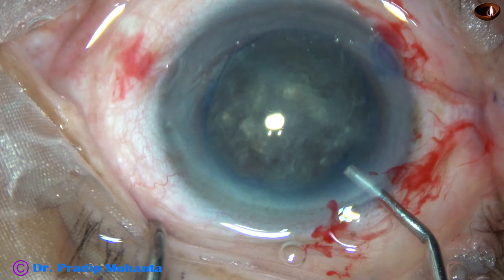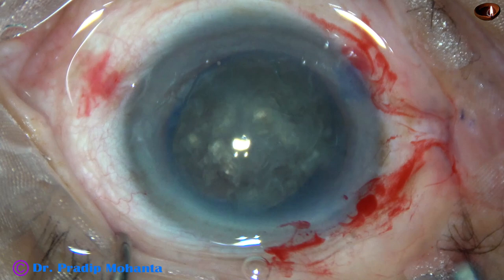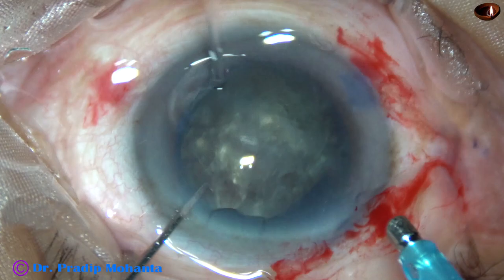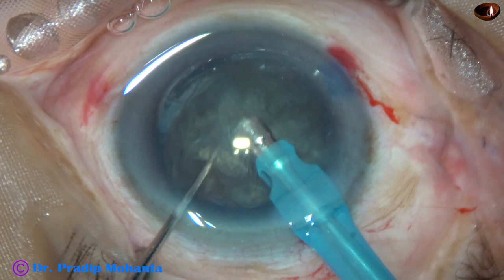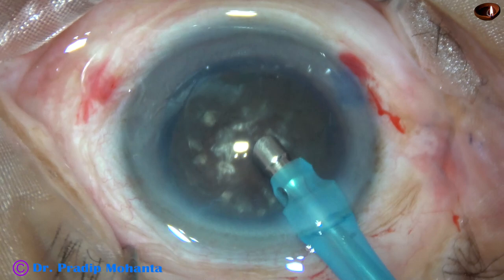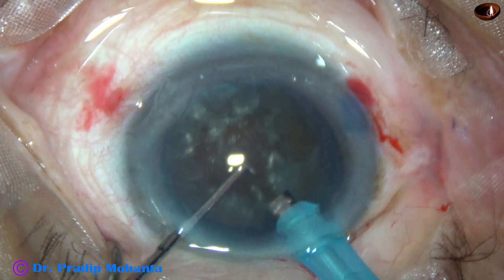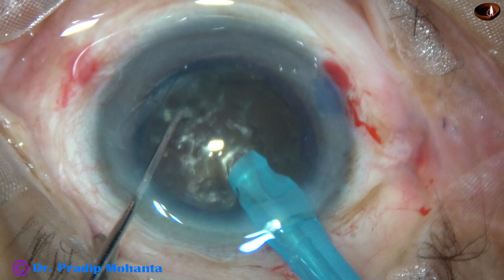The nucleus is now free from the capsule. Now the most tricky part of the surgery. The exposed part of the phaco tip has to be a little more than for routine soft cataracts — at least this much, but not more than this also. Some superficial cortical lens matter is removed. The handpiece is turned, bevel is made up towards cornea. And now this is submarine chop. The tip is buried just in front of the main incision and travels through the substance of the nucleus towards the opposite equator.